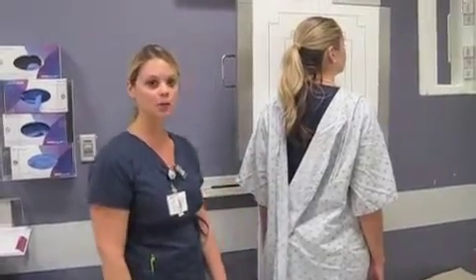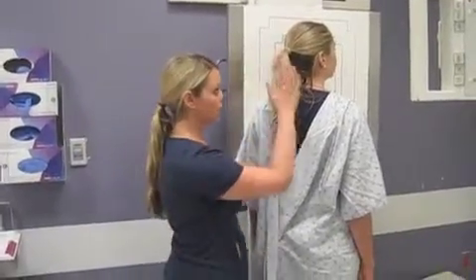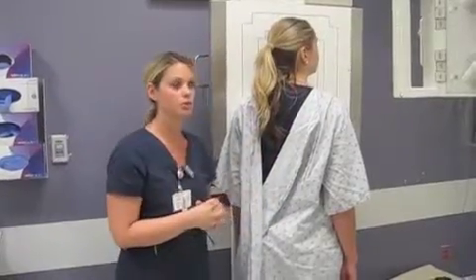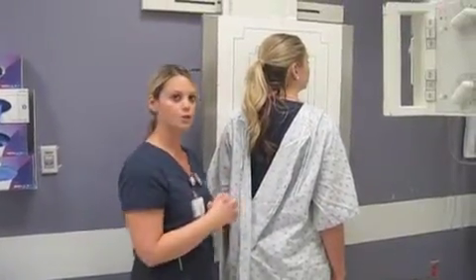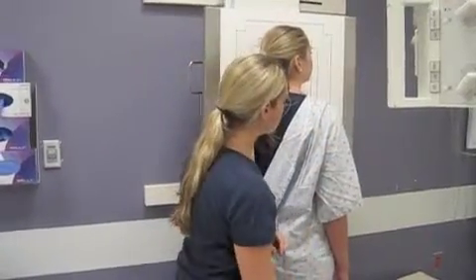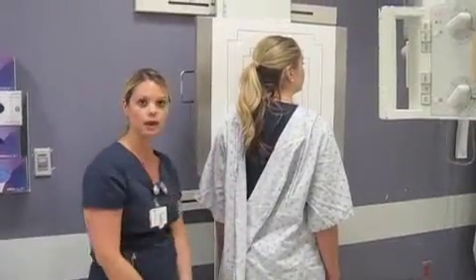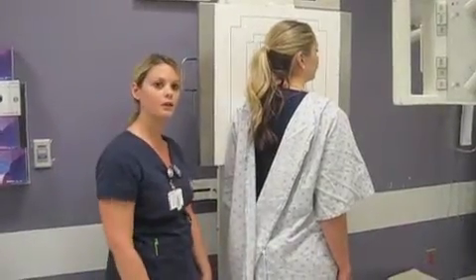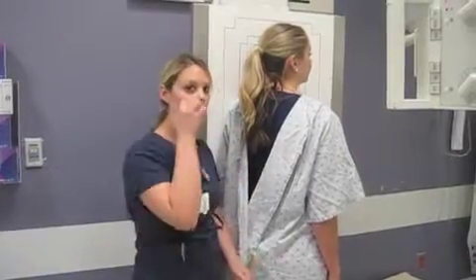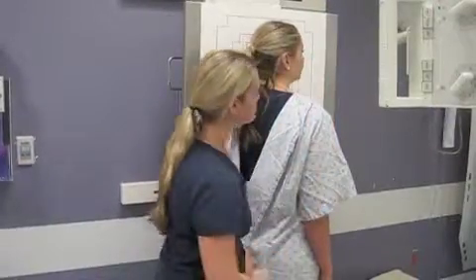Okay, now I'm going to do the lateral view. She's going to be in an LAO position. Her mid-sagittal line is going to be parallel to the IR. The beam is going to be perpendicular. Also, her interpupillary line, which is this line here, is going to be perpendicular to the board. And her head is also going to be in a true lateral for that one. Central ray for this one is going to enter half to 1 inch posterior to her outer canthus, so it's going to be right here.